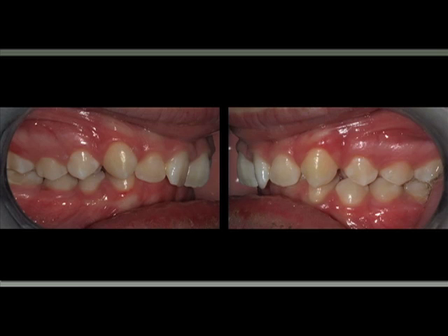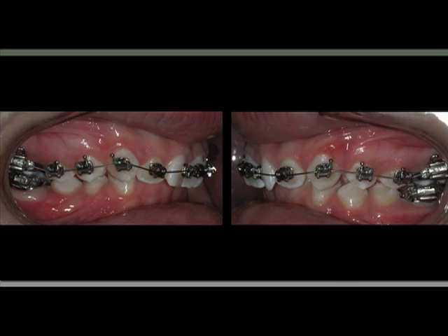Just to parallel the upper and the lower occlusal plane and coordinate the arches. So you can see here we start with the upper arch in order to create an overjet to be able to basically flatten the lower occlusal plane, basically to level the curve of Spee.